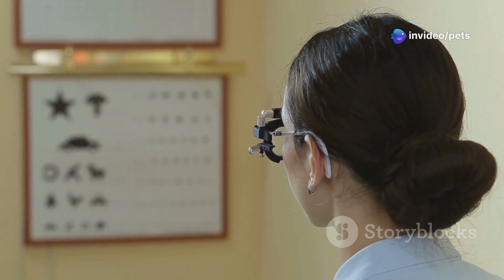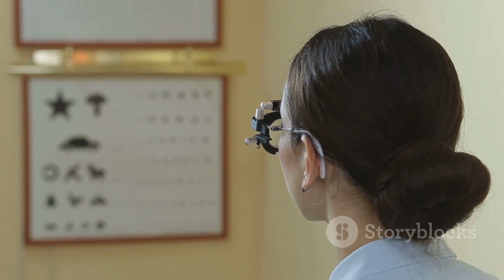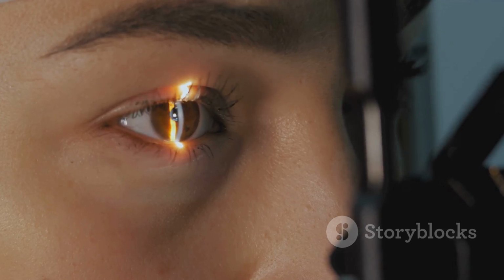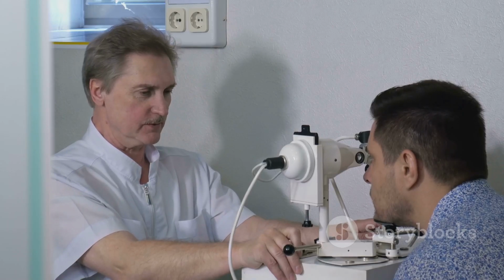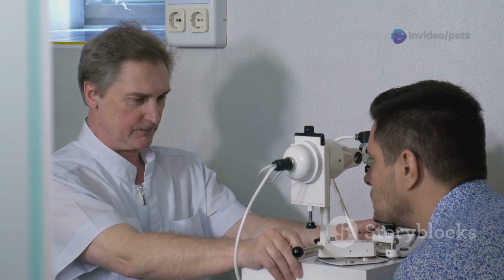Retinoscopy is an essential technique used by optometrists to determine a patient's eyeglass prescription. It involves shining a light into the patient's eye and observing the reflection or reflex off the retina. This reflex provides valuable information about the eye's refractive error, which is the degree to which the eye can focus light onto the retina. Retinoscopy is considered an objective measurement, meaning it does not rely on the patient's subjective responses.